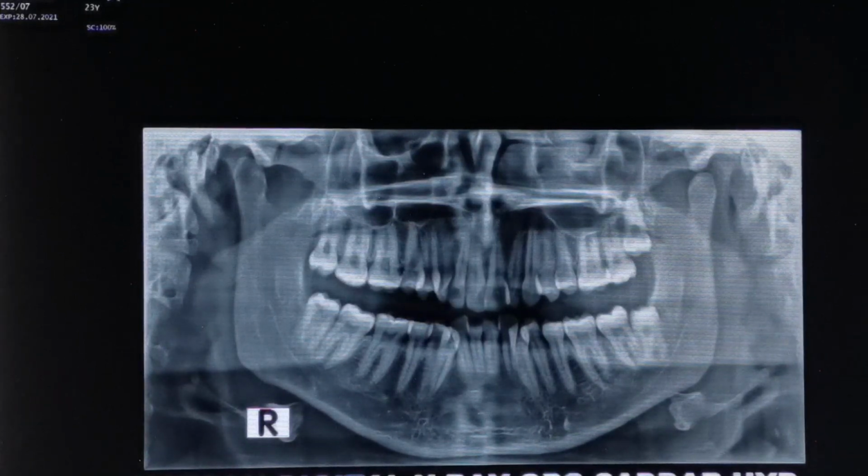First of all, I am going to discuss the maxillofacial surgery field, the surgical department. Why is this X-ray useful? It is useful to detect any mandibular fracture.